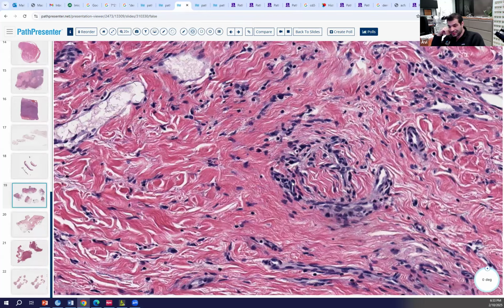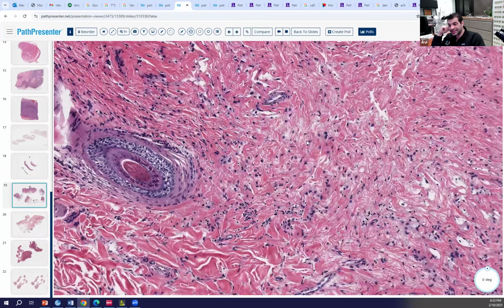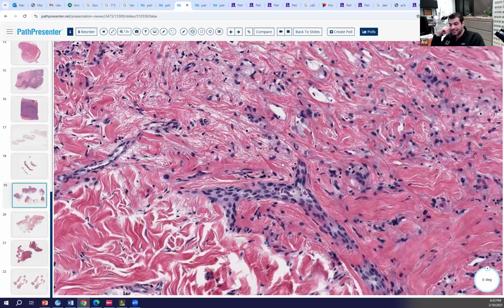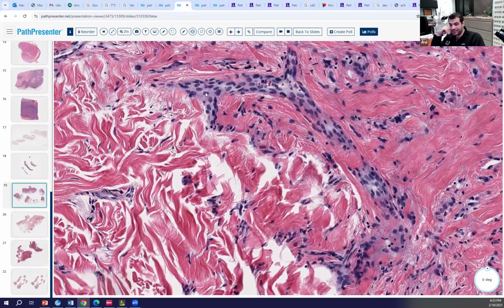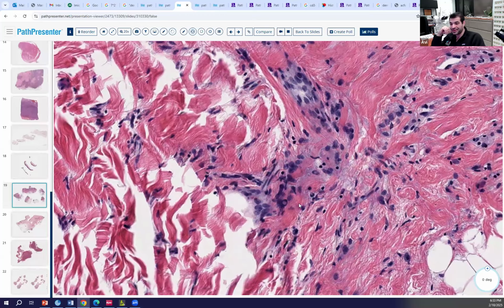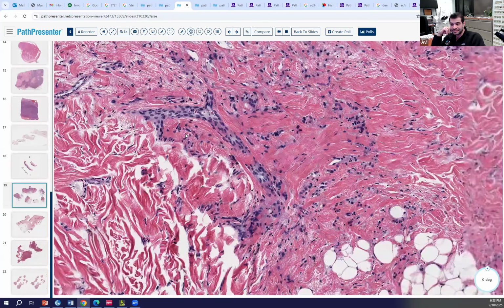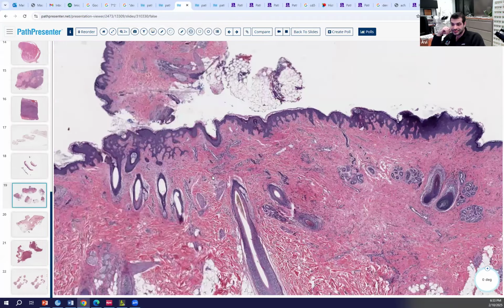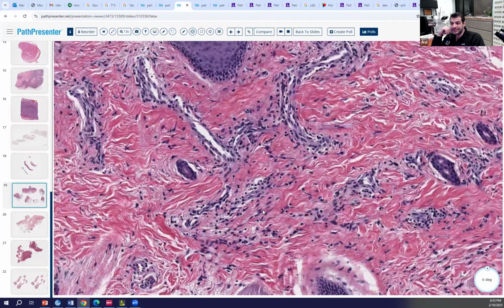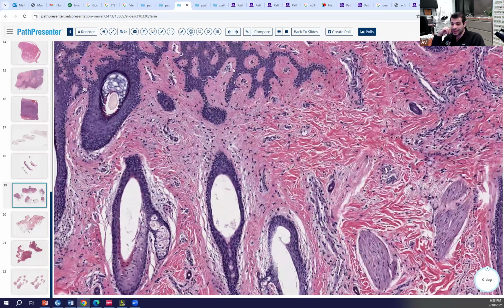These are pretty epithelioid, though, and some vascular things can be epithelioid. But in this case, they're forming an almost syncytial or pseudosyncytial type of look. They're really aggregating up. Sometimes it could be more subtle. And there, of course, are real vessels in the background as well.